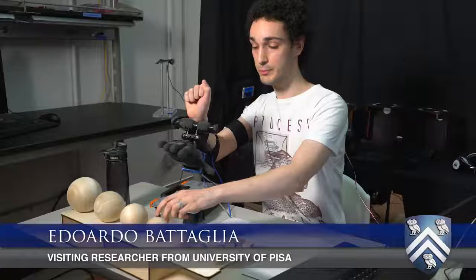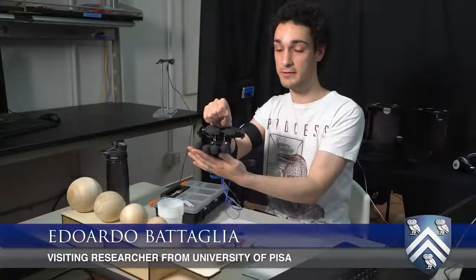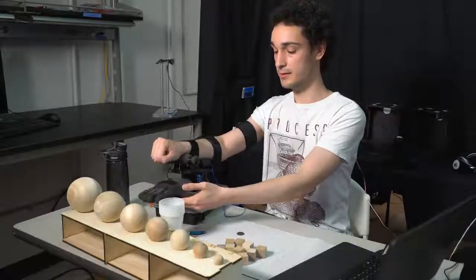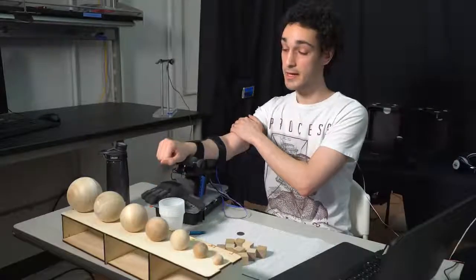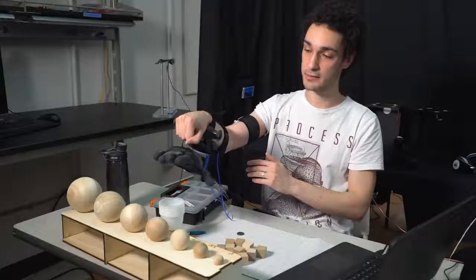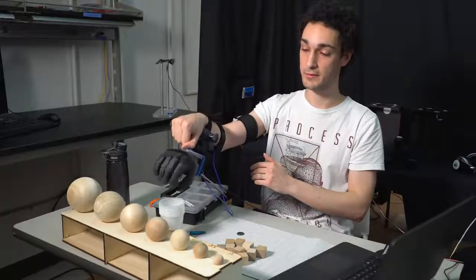transradial amputees. People that use a prosthetic hand would like to be able to feel with their hands like if they were their own, like we do with our hands. So for this reason, we are working on integrating this haptic feedback device that is able to tell you how open and close the hand is, so you can feel the hand movement on your arm.